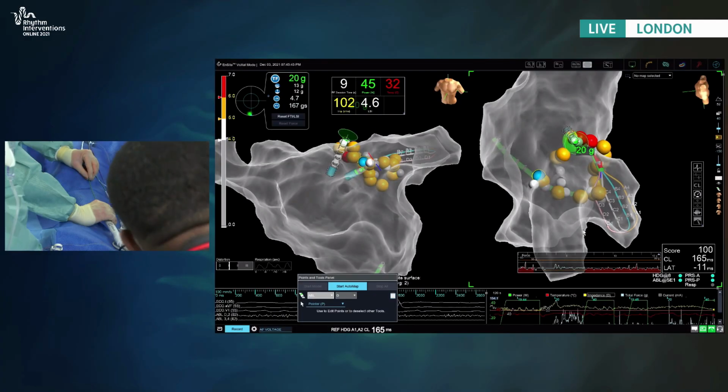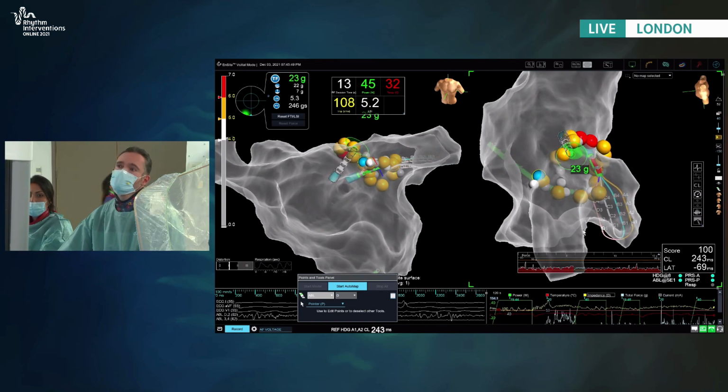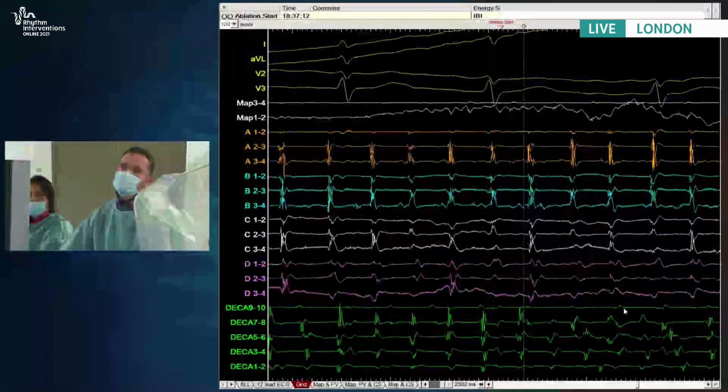While you're pulling this up, Ross, may I ask? See the electrogram out there? Well, Mikey, do you want to show us a screen with... May I ask, when we feel that PVI is the mainstay of therapy, even in long-standing persistent AF, I do appreciate that big boys like ourselves need big toys, and I do think the HD Grid's a terrific device for that. But what's the added value in a first-round procedure like this one compared to a standard circular mapping catheter?